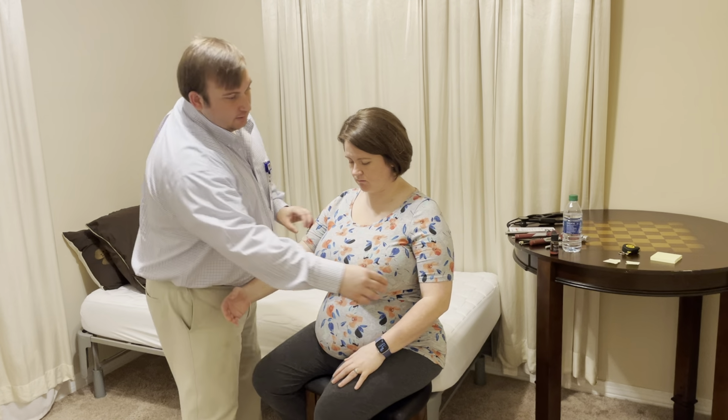Okay, now I'm going to go ahead and auscultate her lung sounds. Breathe in and out. Deep breath in and out. Deep breath in and out. Deep breath in and out. Deep breath in. Deep breath in and out. Okay, good job. We can turn around now.